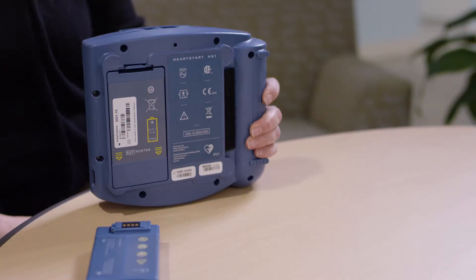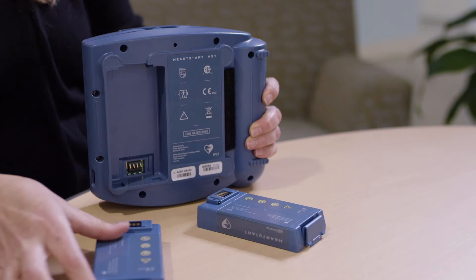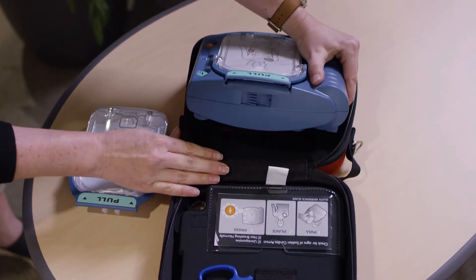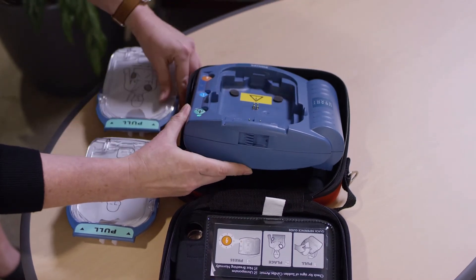When it comes time to replace the battery and pads, all you need to do is pop out the old battery, slip in the new battery, slide this lever to pop out the old pads, and drop in the new pads.